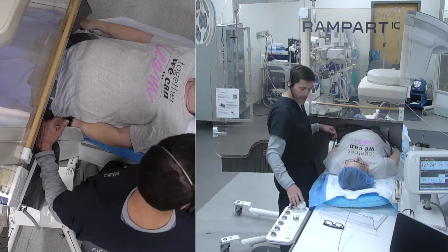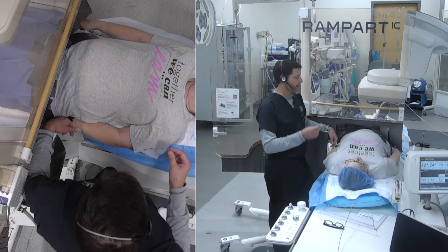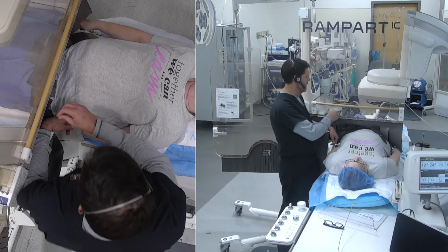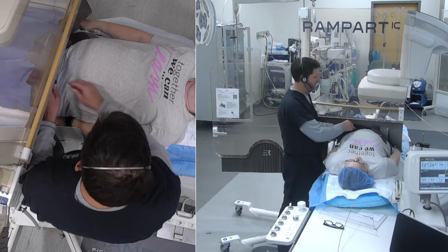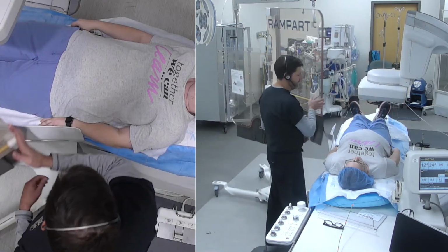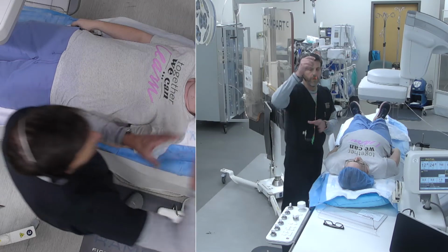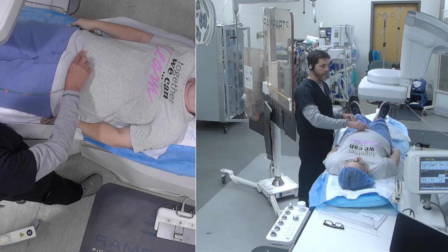Now, if you're going to do a left leg to right leg, I do those in this position as well. The only caveat to that is that I will put on my lead apron and be on the other side and go get my access. The reason that I do that, and you can do it, is you can just move the Rampart out. It's very easy to move out. You have your lead apron on, and you basically just go up and over. Typically, once again, we use a longer sheath, a 65 centimeter destination sheath, to take this up and over.